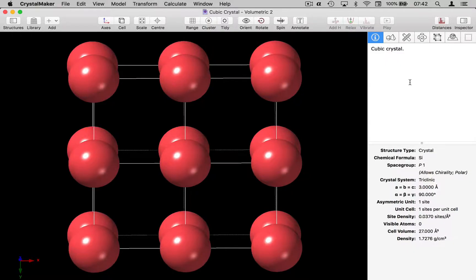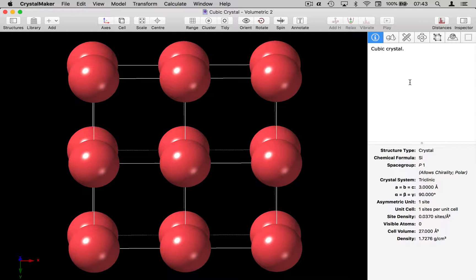Here I have a cubic crystal and we're going to investigate simulating electron density for this simple crystal.